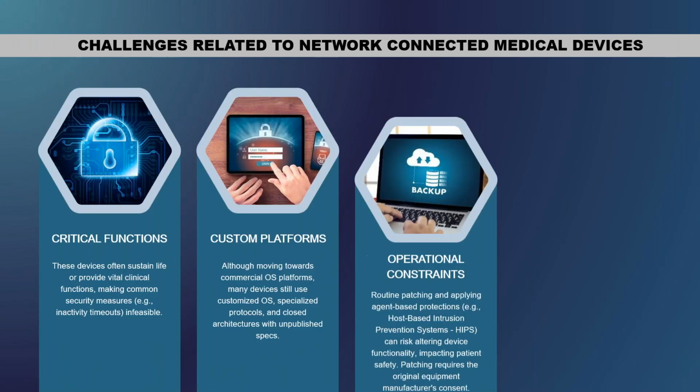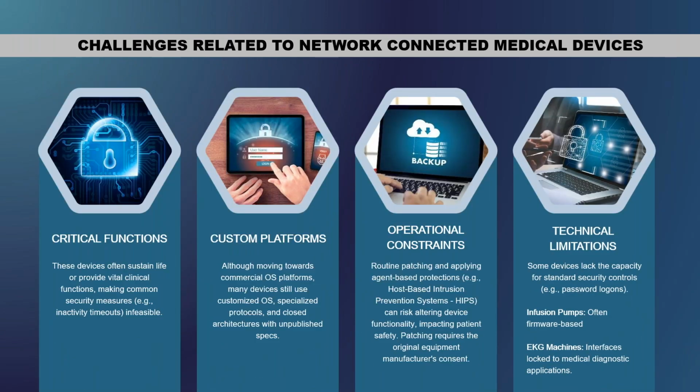Right. And then challenges related to network connected medical devices and their critical functions. For example, these medical devices sustain life. They're clinical vital support, like life support. For example, a defibrillator: you can't put multi-factor authentication onto a defibrillator because that's just not possible.